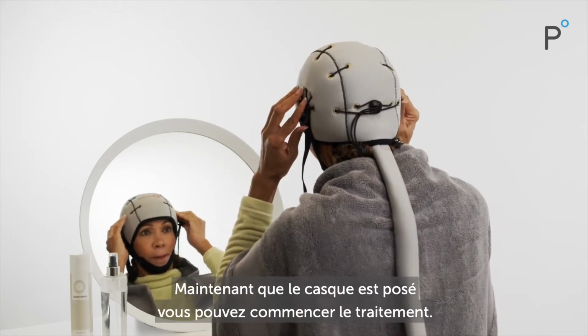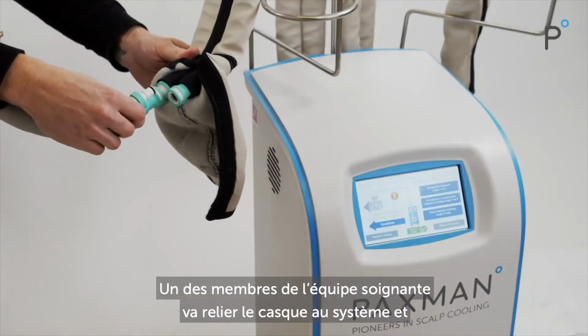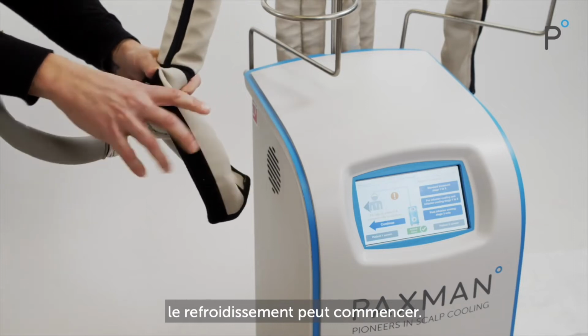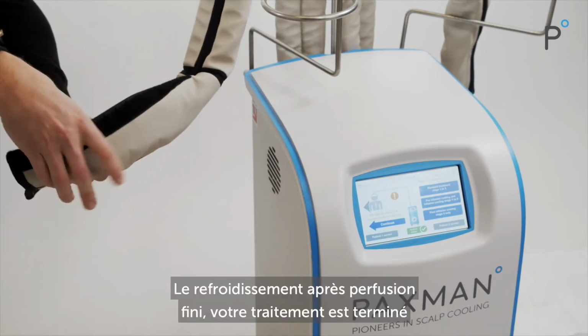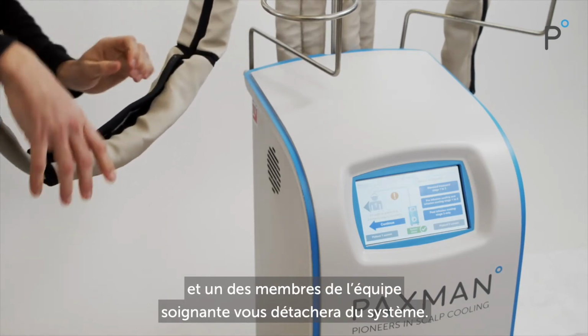Now that your cap is properly fitted, you are ready to start scalp cooling. One of your clinical team will attach your cap to the system and the pre-infusion cooling can begin. Once the post-infusion cooling time is complete, your treatment is finished, and one of your clinical team will detach you from the system.